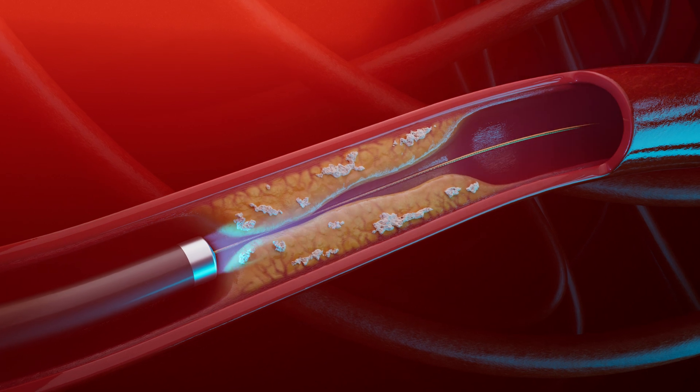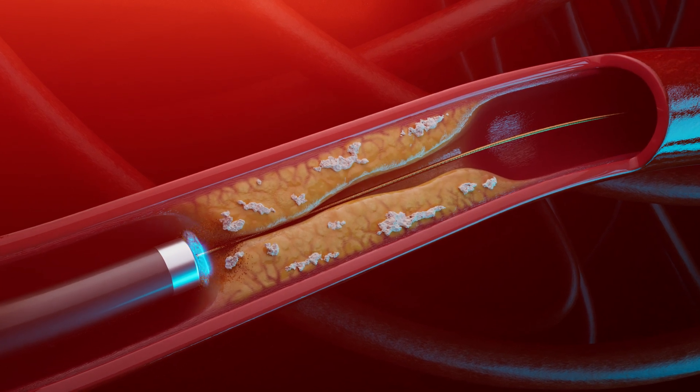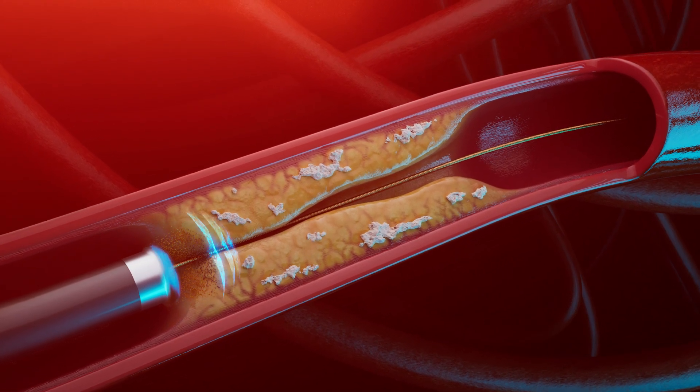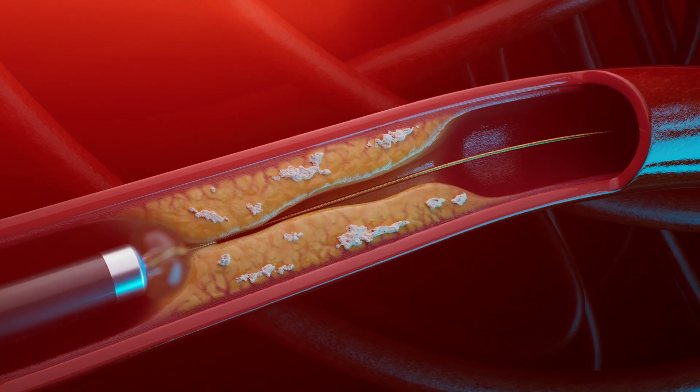Optimal luminal gain can be achieved by slow advancement of the laser catheter, allowing the laser light to work on various morphologies.